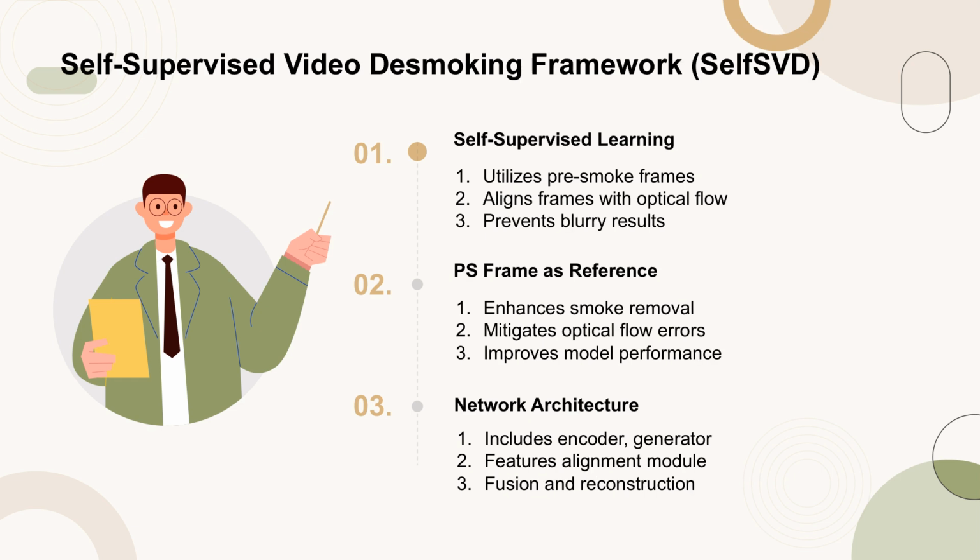The proposed SelfSVD framework employs self-supervised learning by leveraging pre-smoke frames as supervision. This approach aligns frames using optical flow to prevent blurry results. Additionally, the framework takes the pre-smoke frame as a reference input to enhance smoke removal, mitigating errors in optical flow estimation. The network architecture is designed to include a feature encoder, a masked ref generator, an alignment module, and a fusion and reconstruction module to process surgery videos online.